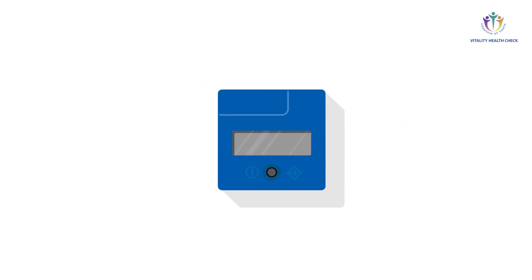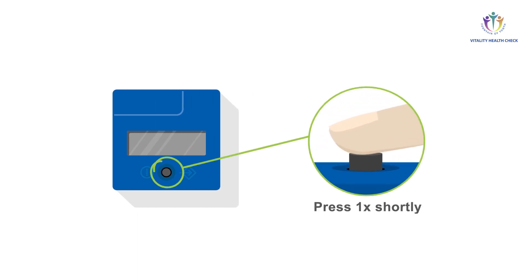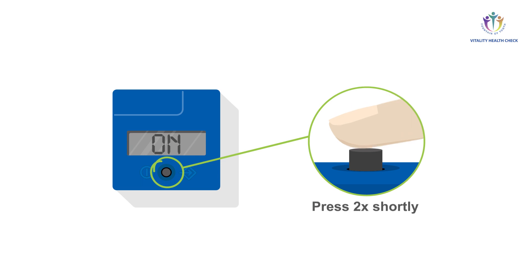After any battery replacement, the internal date setting must be checked. To check and set the internal date and time, press the button of the VHC reader twice in rapid succession right after the device has passed its self-test and the display shows on.